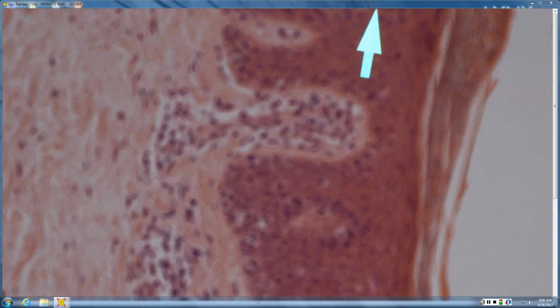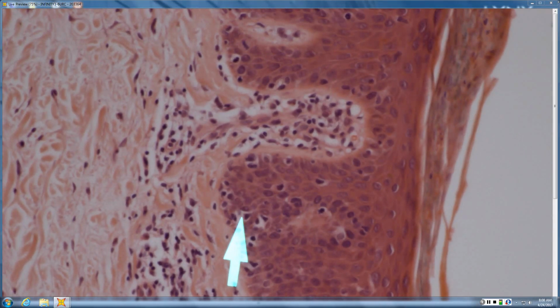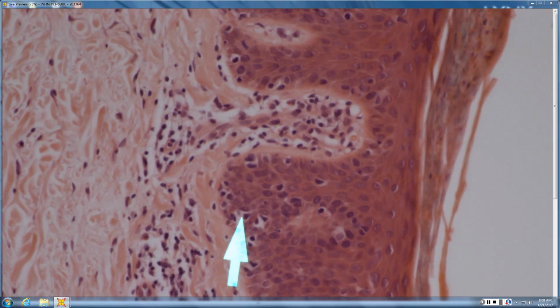If you look at deletion markers, things like CD7, the new criteria are that the malignant population should have 90% loss of CD7 when compared to the benign recruited lymphocytes in the dermis. They used to say 50. The problem is CD7 is always weaker, so people were over-reading loss, and so they said it ought to be 90%, a really dramatic loss of CD7 in order to call it.